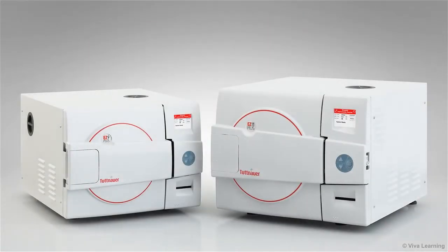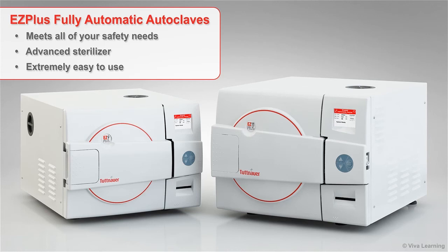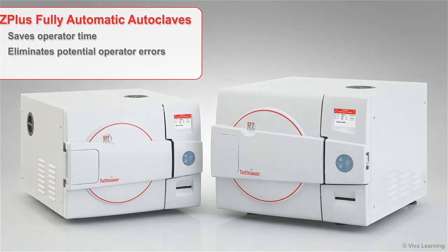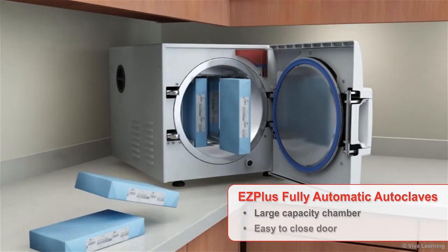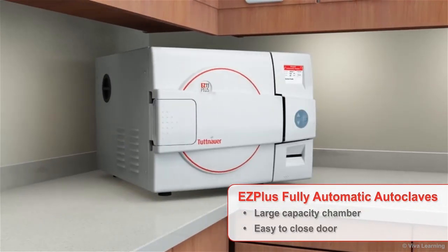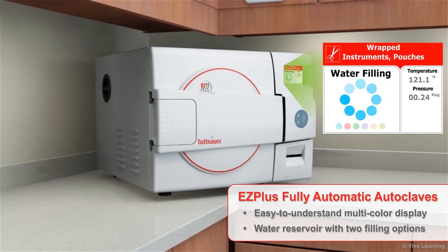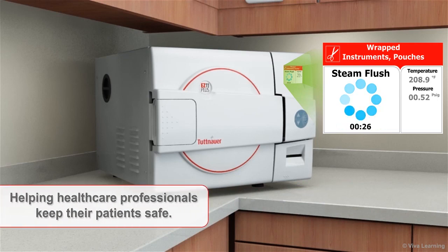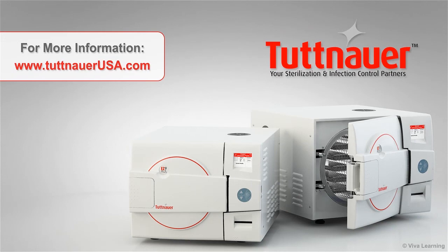With sterilization, safety always comes first. The EZ Plus fully automatic autoclaves meet all of your safety needs with an advanced sterilizer that is extremely easy to use. EZ Plus is designed to save operator time and eliminate potential operator errors within the healthcare practice setting. With EZ Plus, you get a large capacity chamber, an easy-to-close door with an automatic double-safety locking mechanism, an easy-to-understand multicolor display, a water reservoir with two filling options, and more — all backed by a comprehensive warranty. EZ Plus fully automatic autoclaves from Tuttenauer, helping healthcare professionals keep their patients safe.